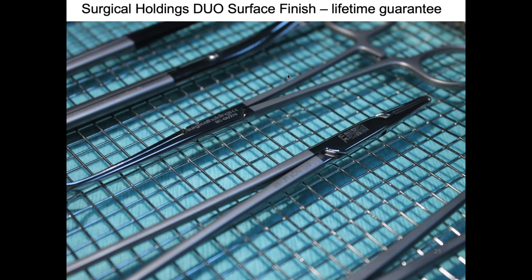The picture of some of our instruments just shows you can achieve a really definitive finish change between the different areas of the instrument. If you're manually polishing it and you have the skill to do so and finish it correctly, then you can finish to a really, really bright polish, and you can still apply a different texture to the instrument whilst maintaining a smooth surface finish. So it's something to be aware of, that not all surface finishes will behave the same.